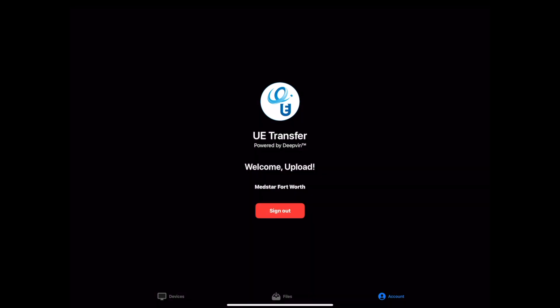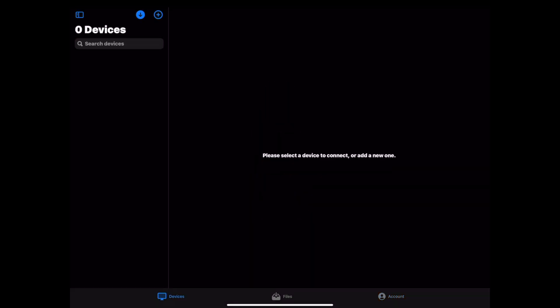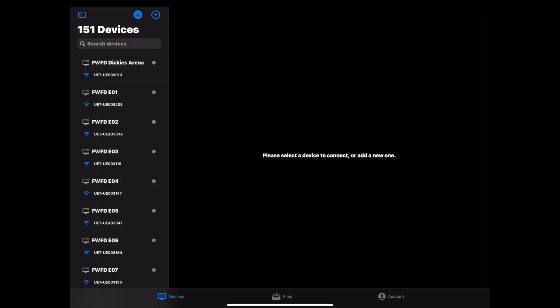Next, you will either tap Devices in the bottom left corner or the Device icon in the top left. If the device list is not already populated, you're going to click the blue down arrow to download the system's device list.